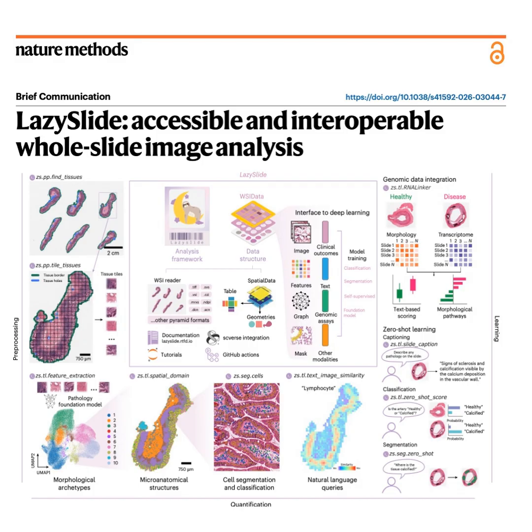What did they find? They found that combining the visual images with the RNA data uniquely identified IL-18 signaling as a key pathway driving the calcification. Yes. And the crazy part is, if the researchers had only looked at the RNA data by itself, if they only looked at the power grid, they would have completely missed it. Really? Yeah. When they took just the RNA data and projected it into UMAP space to visualize the clusters, the healthy patients and the calcified patients did not cleanly separate. The transcriptomic data alone was just too noisy.